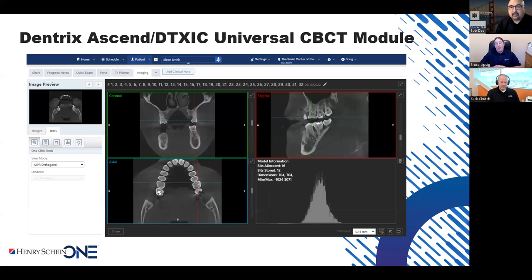No, I appreciate that you did. I don't usually talk about that component, but the truth is that there are other companies that put out clinical diagnostic imaging without sending it through the FDA. And it makes people wonder how they could use such a product to diagnose and treatment plan from an X-ray that wasn't brought in by FDA cleared diagnostic software. So, that's always a precursor to shopping for anything in the USA.